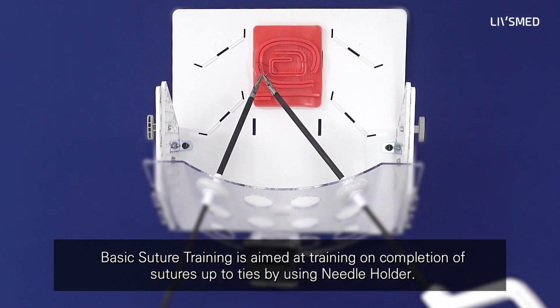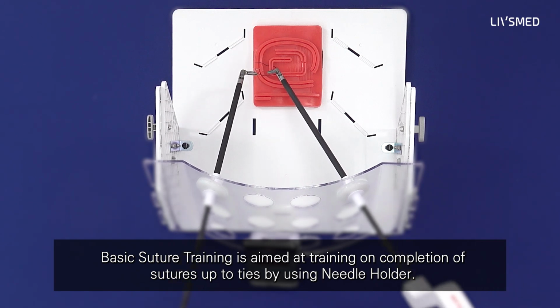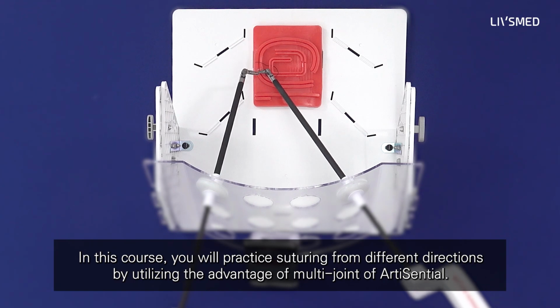Basic suture training is aimed at training on completion of sutures up to ties by using a needle holder. In this course, you will practice suturing from different directions by utilizing the advantage of multi-joint of ArtiSential.